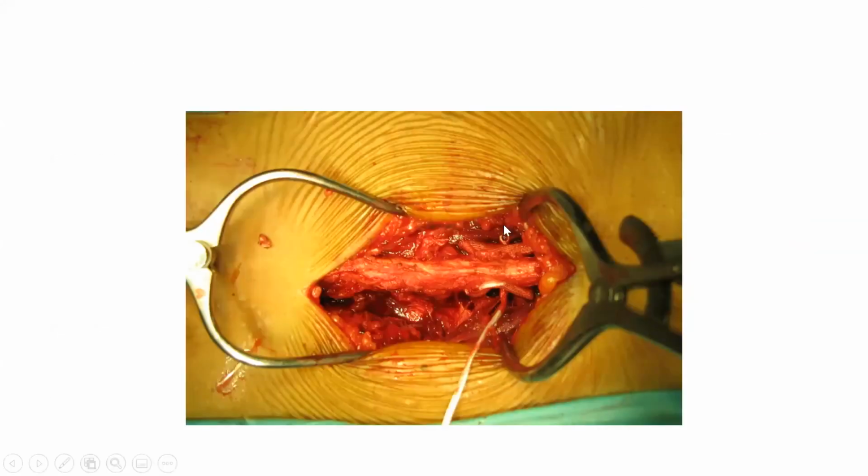But they don't work. Almost every single one, the spinous process erodes away, and you lose height. I thought it might prevent recurrent disc herniation. I was hoping it would prevent patients needing fusions. Of all the 10 I put in, I've taken every single one out, and not a single one of them prevented the patient developing the consequences of disc degenerative disease. So I don't do them anymore.